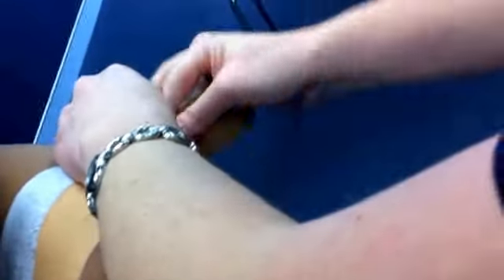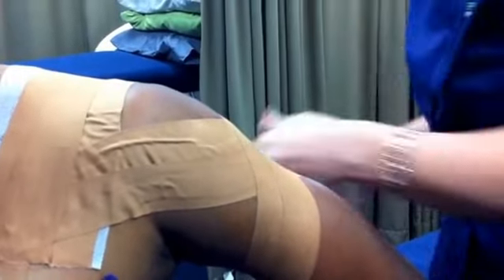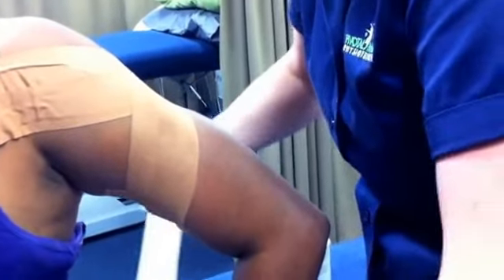Two strips are placed proximally and distally to stabilize the tape afterwards. The proximal strips are applied anterior to posterior as shown. The distal strips are gently applied with the patient actively contracting the biceps muscle to prevent discomfort.